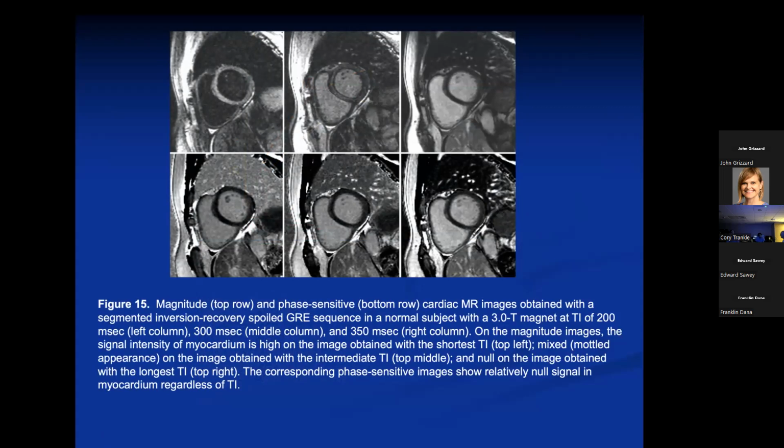Basically, you're getting another image that allows you to assess polarity, so to speak, whether or not you're above or below the zero crossing. So at this point, it recognizes that you're too early. This apparent high signal results from you being below, not above, the zero crossing line. And it fixes that. Okay.